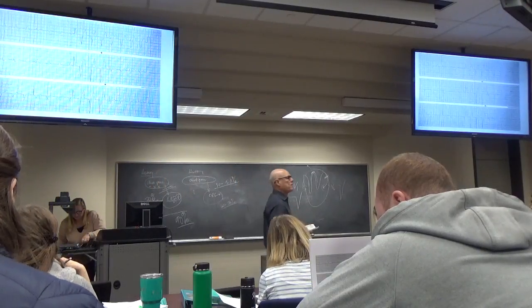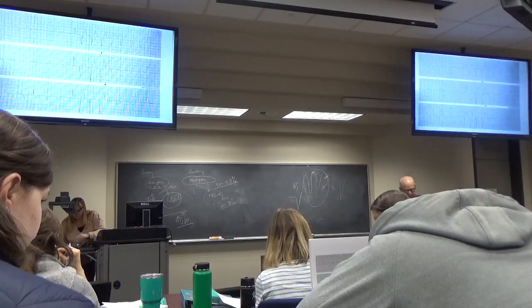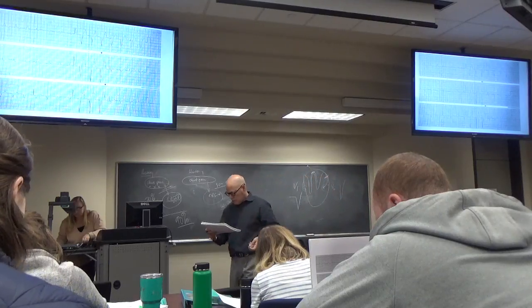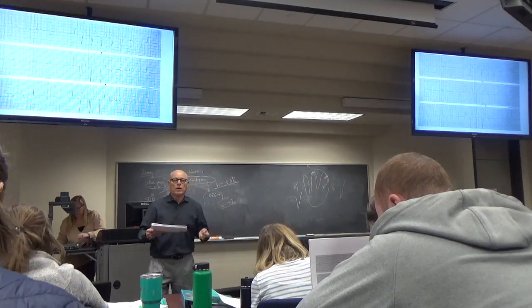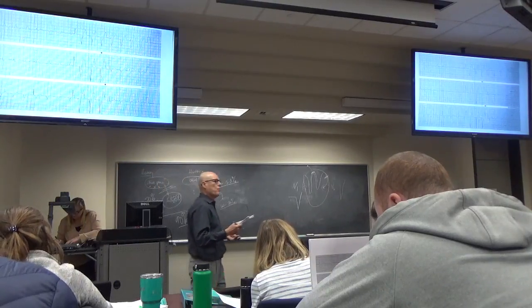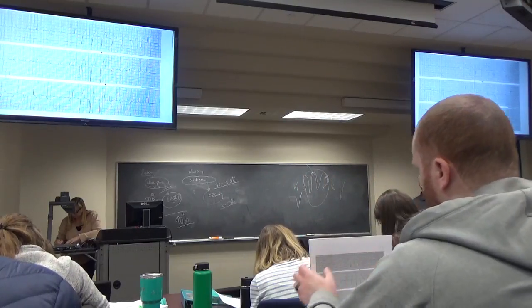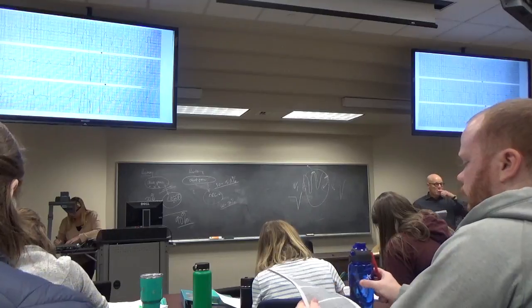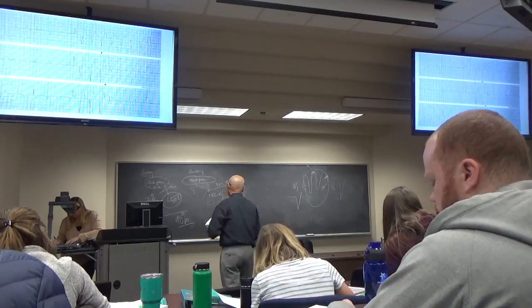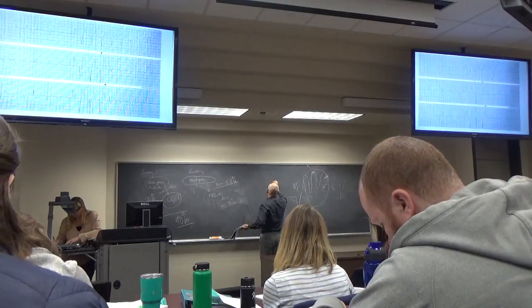I think I have right myself. So this is another one that's difficult. I think it's a right bundle branch block because of the way V6 looks. Why aren't there rabbit ears in V1? Because you have a Q wave, right? And if you have an anterior infarct and a right bundle, you won't have an RSR prime in V1. So that's why you always look at V6. What's going on in V6? With a right bundle branch block, V6 looks like this.